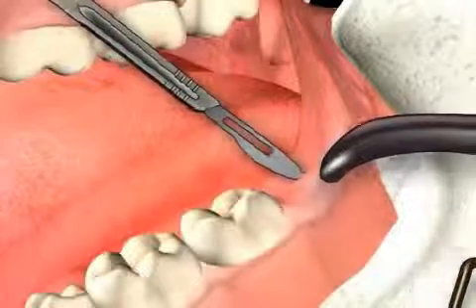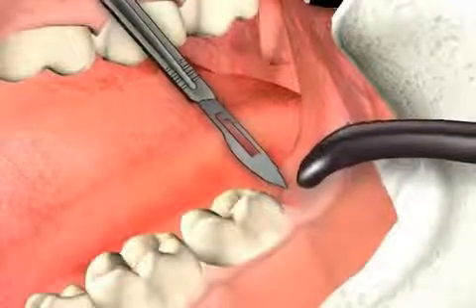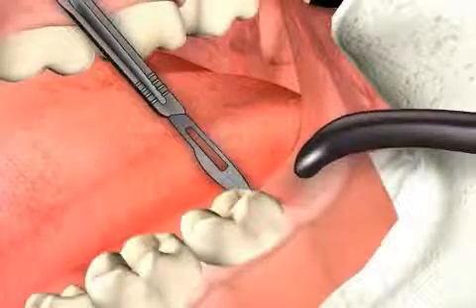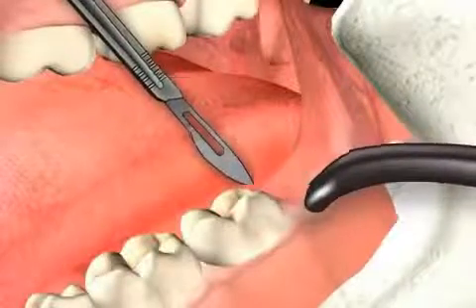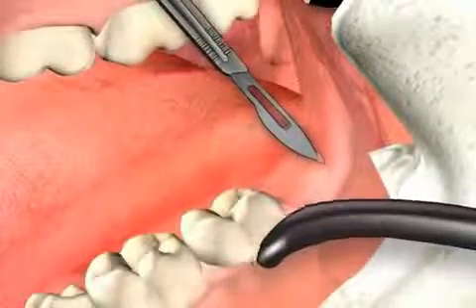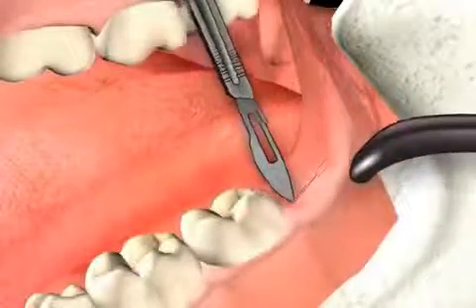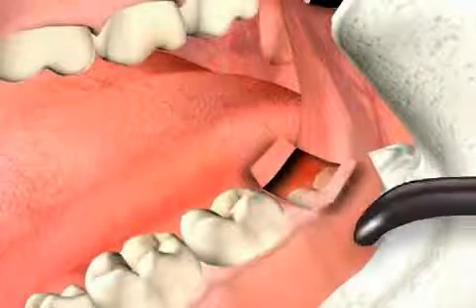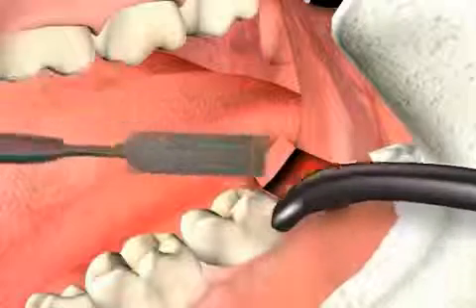First, the surgeon obtains an overview. He palpates the ascending branch of the lower jaw and properly places the Langenbeck. Then he makes the cut. When doing so, a so-called gingival margin cut is made along the ascending branch of the lower jaw and on the number 7 tooth. You can find out more in the video entitled Gingival Margin Cut.